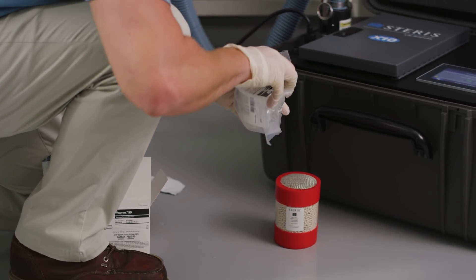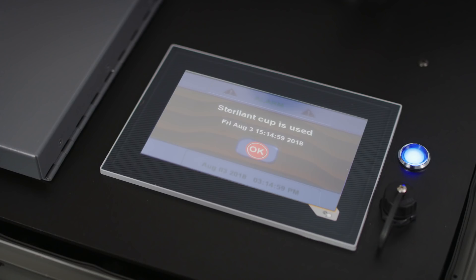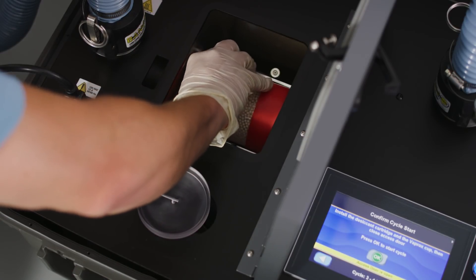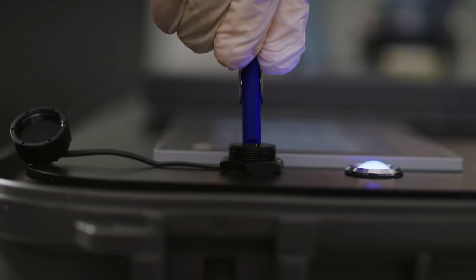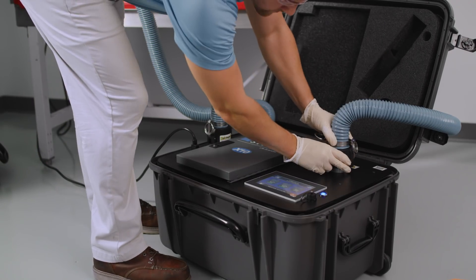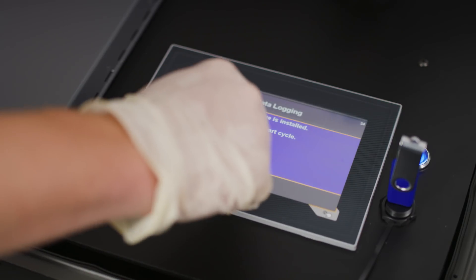Remove the Vaprox from the packaging. On-screen prompts will inform you when to insert a Vaprox cup. If there is a problem with the cup or its contents, such as expired sterilant, users will be directed to insert a new Vaprox cup. Next, you will also be prompted to load a desiccant cartridge. Do not remove the desiccant cartridge from the sealed pouch until directed to do so by the X10 unit. The user is then prompted to insert an optional USB memory stick, which records cycle data. Check once again that both hose connections are secure and confirm proper biological safety cabinet sealing. The X10 is now ready for bio-decontamination. Press the OK button to begin the cycle.